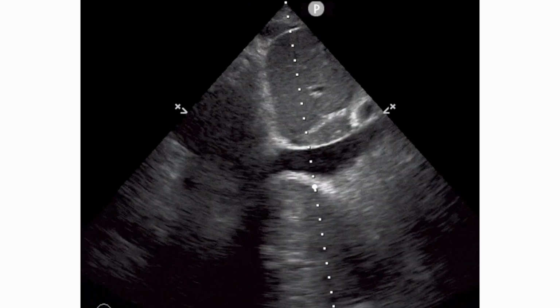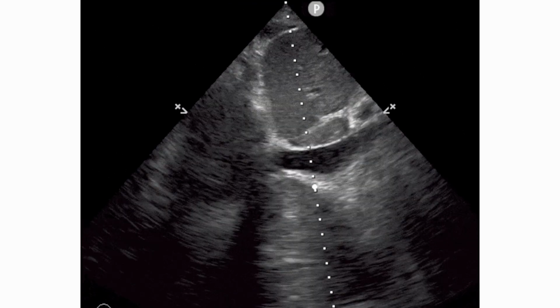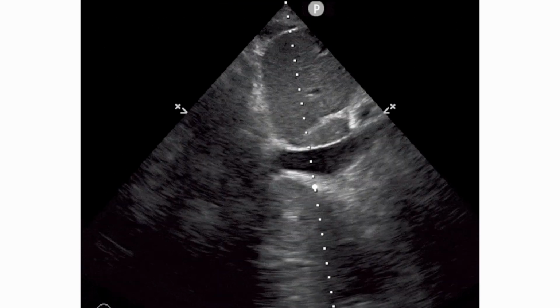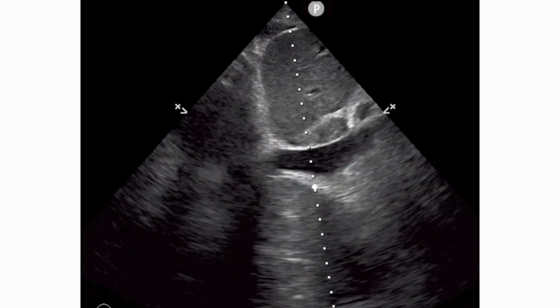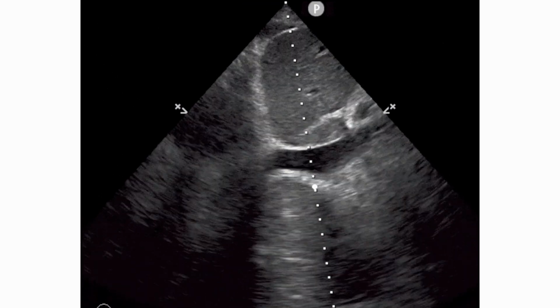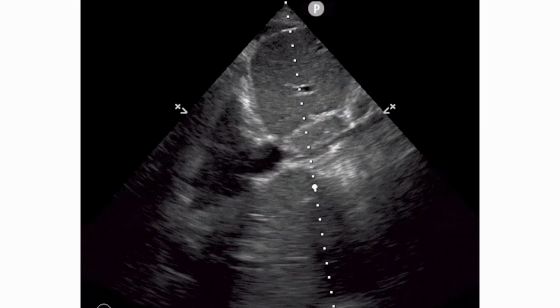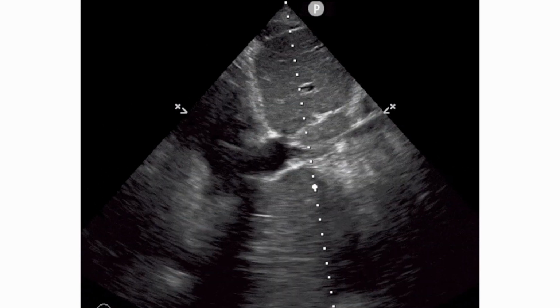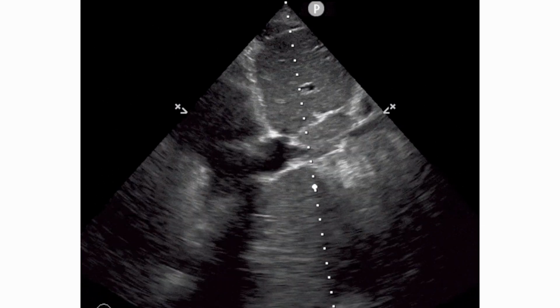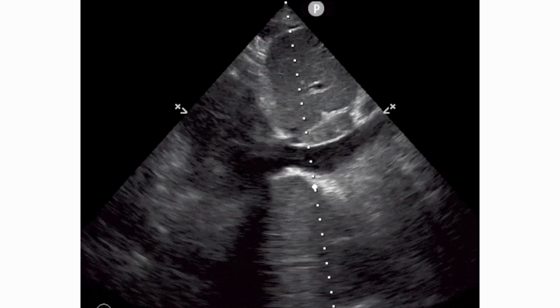So again, in the right setting, if I now have a hypotensive patient, and especially in the setting of trauma, I'd worry about volume or blood loss. Or if they were septic and they were hypotensive, I'd worry that maybe this patient still needs more volume. Or maybe go ahead and keep giving a little bit of volume till we get that IVC a little better, and then we can consider pressors, or maybe starting fluid and pressors at the same time. But you can see how this takes a completely undifferentiated patient and at least gives you an extra piece of the puzzle to work with.